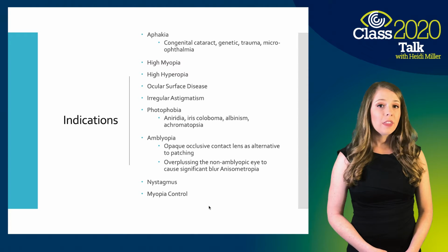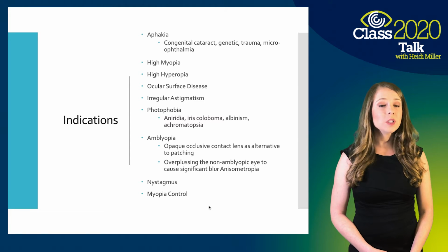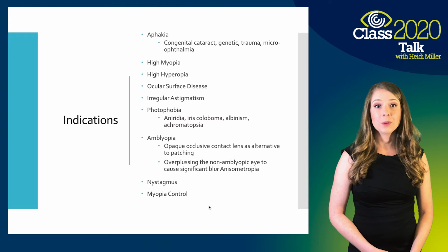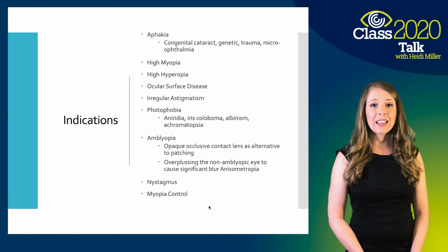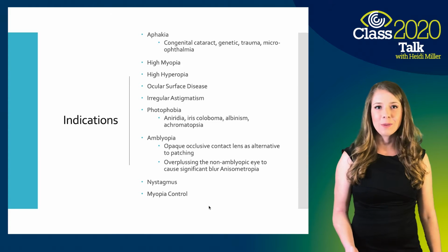Also, amblyopia therapy. A lot of times we don't think about contact lenses for that type of option, such as patching, but that can be a very viable option for pediatric patients when you're struggling with patch therapy. Nystagmus patients have been shown to do a little bit better with contact lenses, especially GP lenses, and obviously our myopia control.